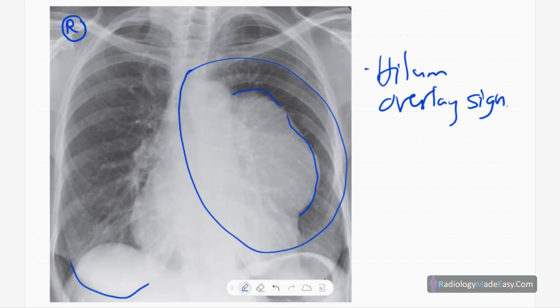The hilum overlay sign is positive. This means the mass does not arise from the hilum — it is anterior to the hilum. Since the hilum overlay sign is positive, this is an anterior mediastinal mass. There are no air-fluid levels, air bronchograms, calcifications, or cavitations.